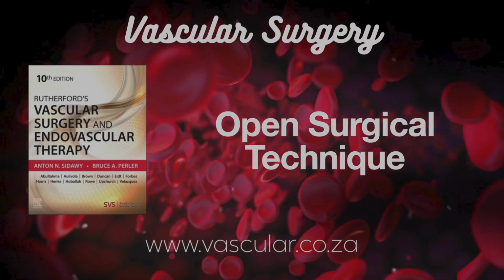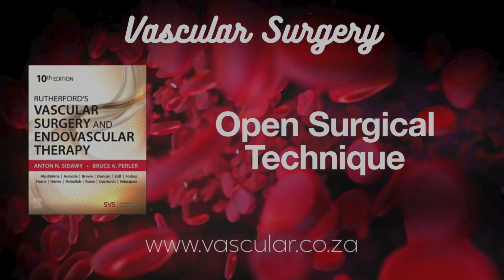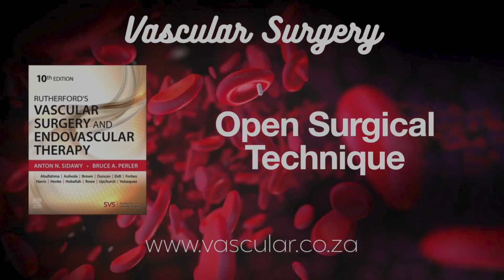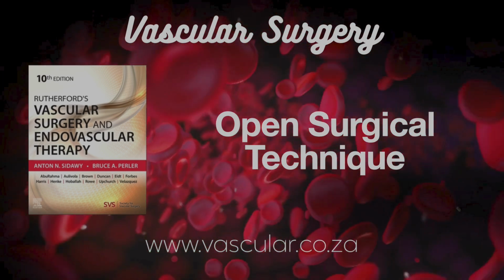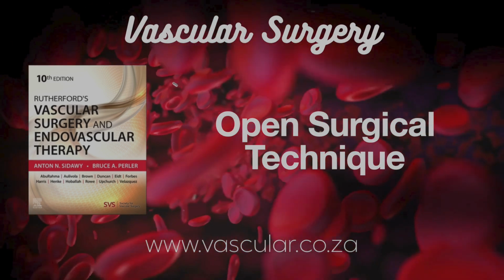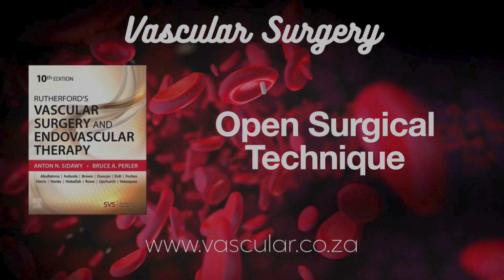And extraction. Using a loop or instrument to grab and pull out plaque extending just beyond the orifice. Generally for short segment disease. Endpoint issues again. Yes, not under direct vision. Careful assessment after flow restoration is key. Especially important for the profunda femoris orifice during femoral endarterectomy. If plaque goes deep into the profunda, need direct inspection, maybe extend the incision and patch.